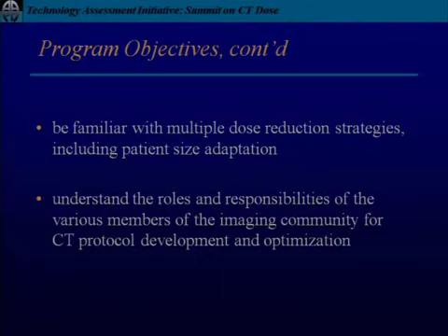Hi. Tom Slovis, Children's Hospital of Michigan. Just to help with the neonate and the young infant, we don't do CT scanning at all in that group. There are very few indications for that group for any CTs of the head. They should all be MRs. And I agree with your clarification about your slide, which said screening of pediatric patients with CT. We don't believe in that.